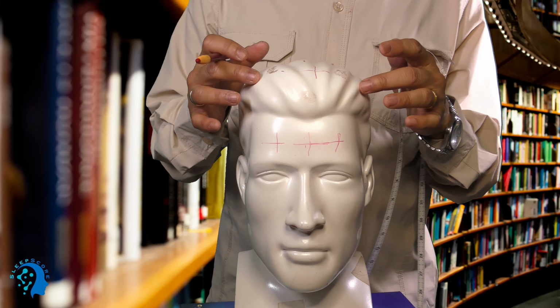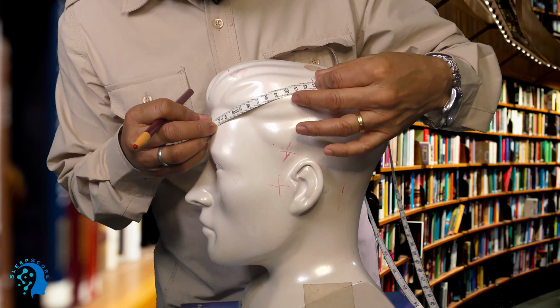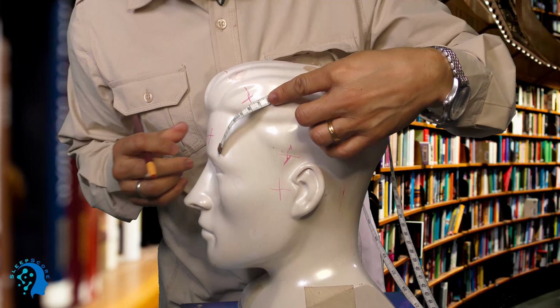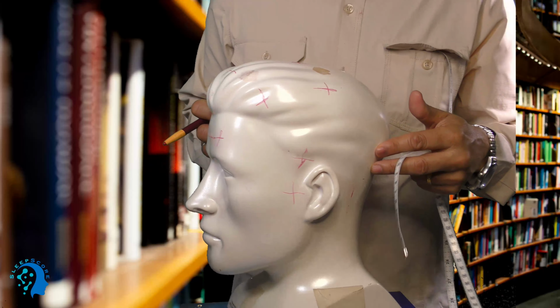So what I do is, from FP1, I go to C3 right here, which is about 13. You can check number 13. I get half of this, which is 6.5 right here. Now I have to do the same thing on the other side.